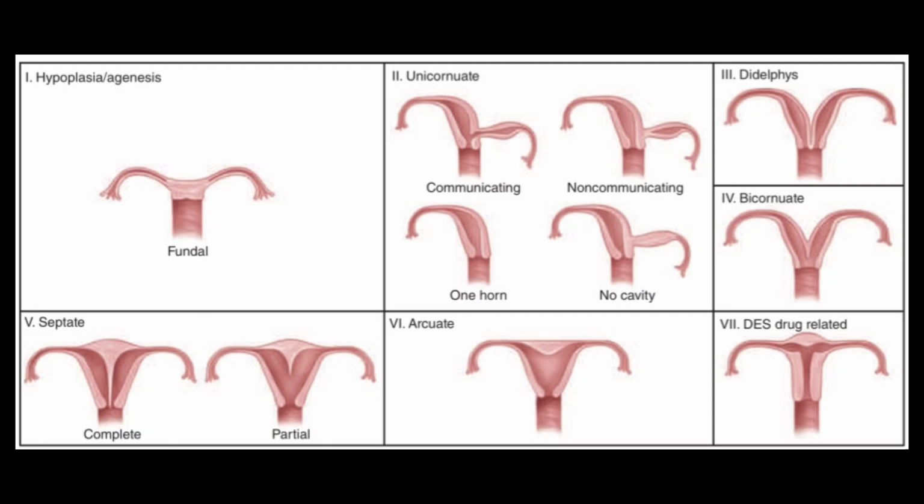On the fifth image, this is a septal abnormality. Septal fusion has not taken place, so the septum is still there, parting both cavities. Within the one uterus there are two cavities. If a complete septum is there, it will be called a complete septate uterus, and if it is partial, look here, you can see a slight indentation within the cavity, so this is a partial septate uterus. Again you can confirm it on hysterosalpingography, on ultrasonography, or you can even put saline in and do the ultrasound scan. You can easily pick that up on ultrasonography as well.